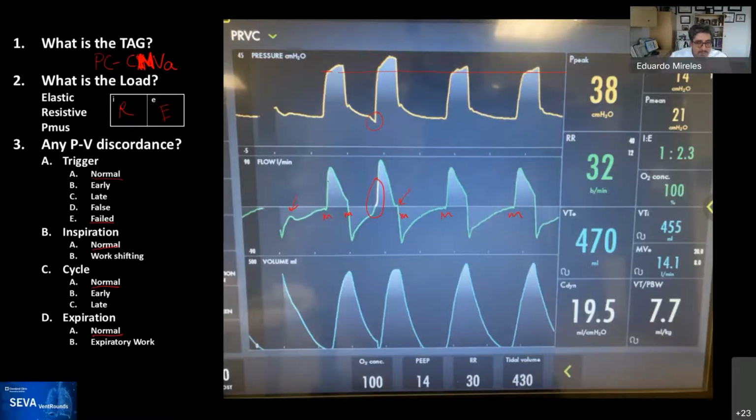Rob, any comments here? No, I have no idea why it's doing that, and we might be able to reverse engineer it in the sim lab, but it would take a little bit of work. Next time we're on the line with the engineers, we should get them to tell us this.